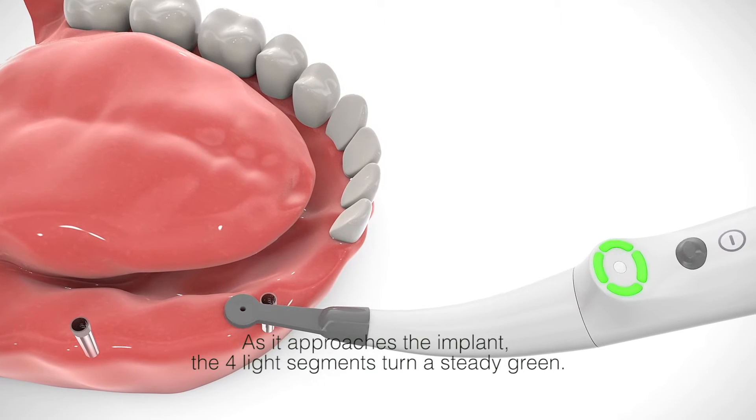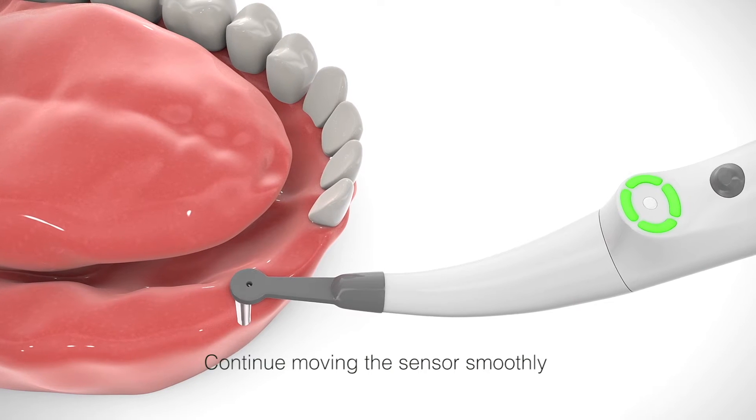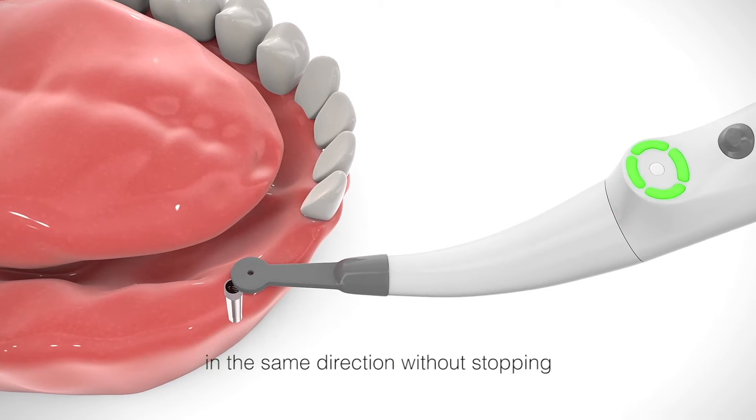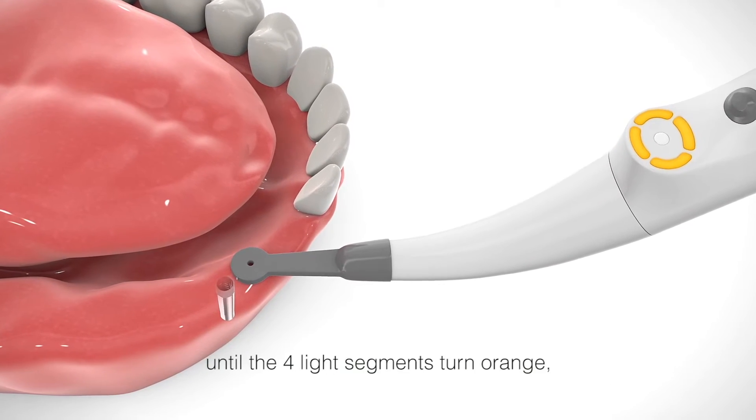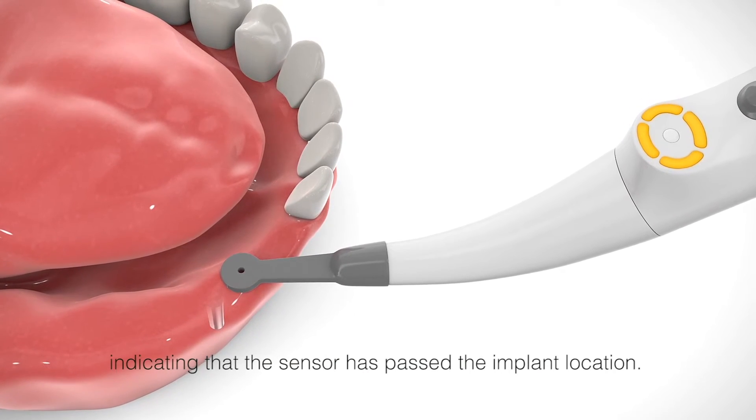As it approaches the implant, the four light segments turn a steady green. Continue moving the sensor smoothly in the same direction without stopping until the four light segments turn orange, indicating that the sensor has passed the implant location.